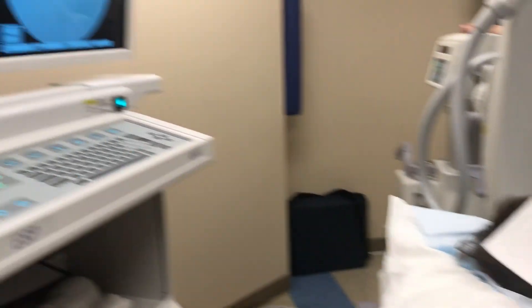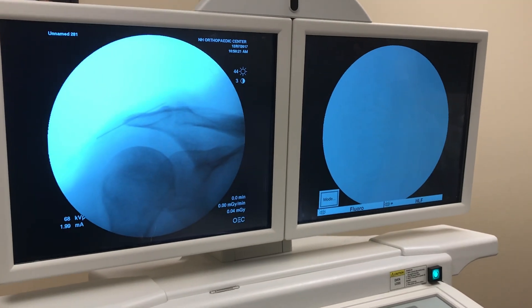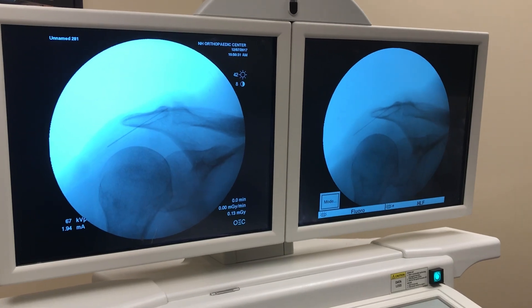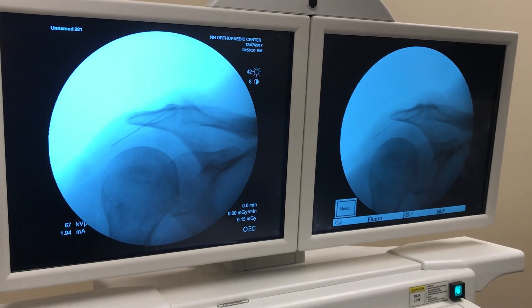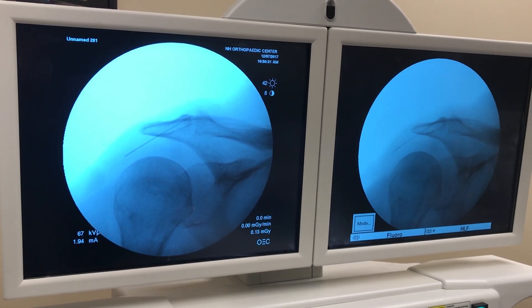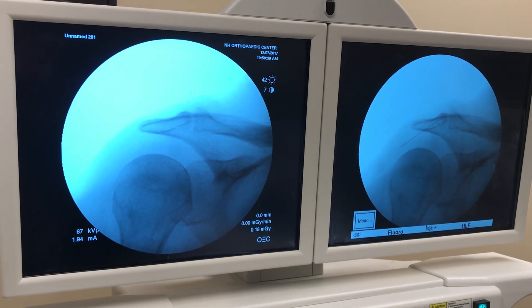Then you can look at the x-ray, just see where we're at. X-ray there. You can see that's right where we want to be. X-ray here, and you can see we're going right down the AC joint there.